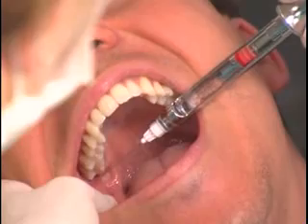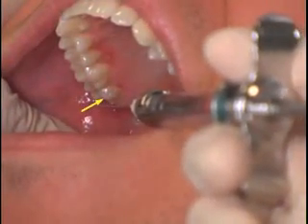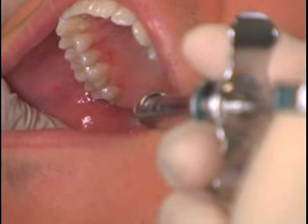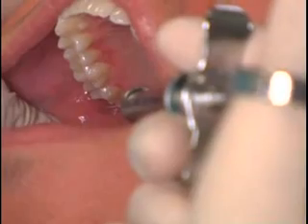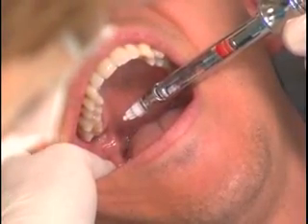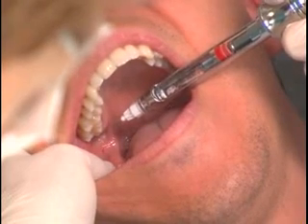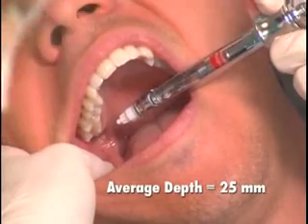tip is placed just below the mesiolingual cusp of the maxillary second molar. And then the needle tip is moved just distal to the second molar. This locates the insertion site for the Gow-Gates injection. The needle is now inserted until bone is contacted. The average depth of penetration in the Gow-Gates injection is approximately 25 millimeters.